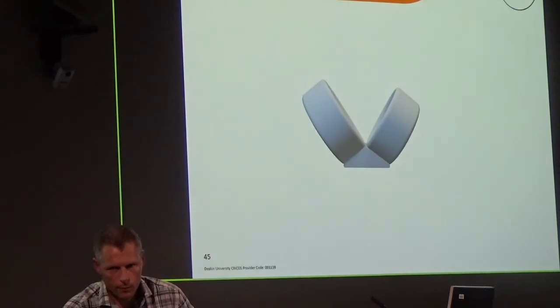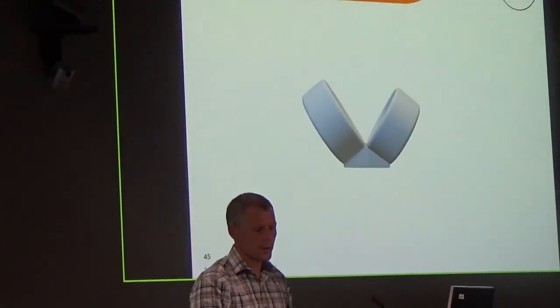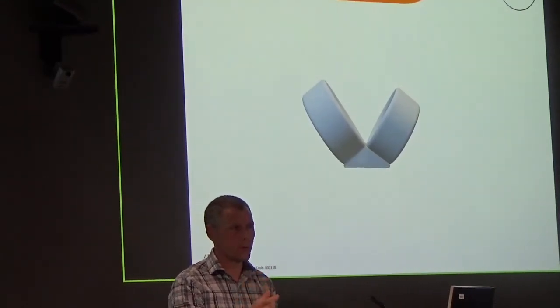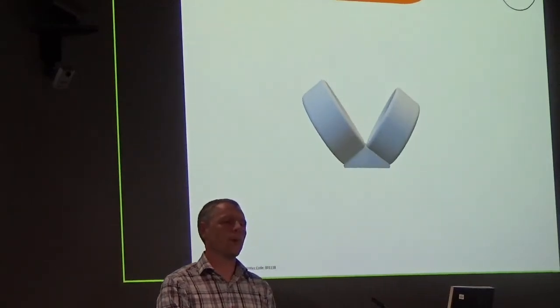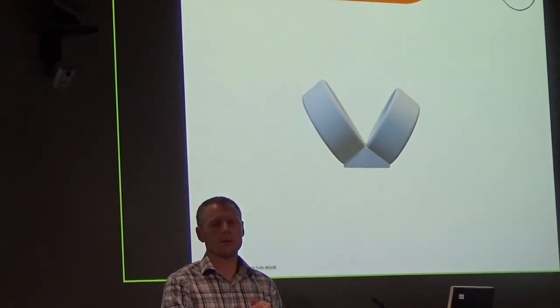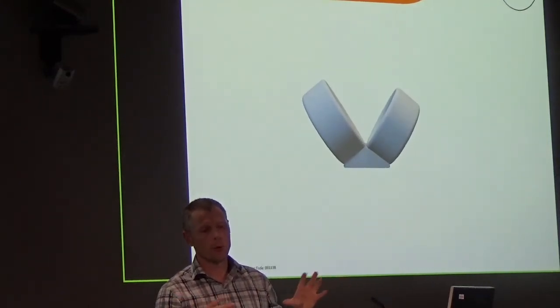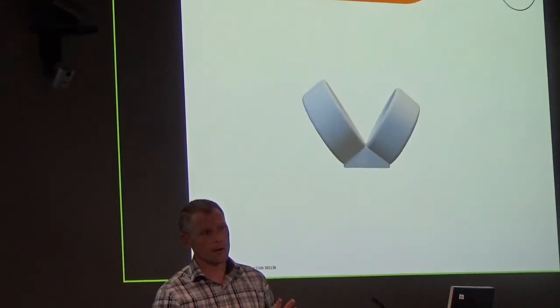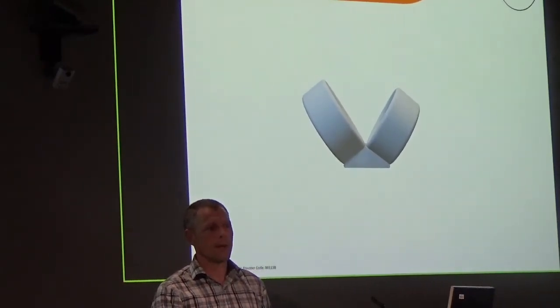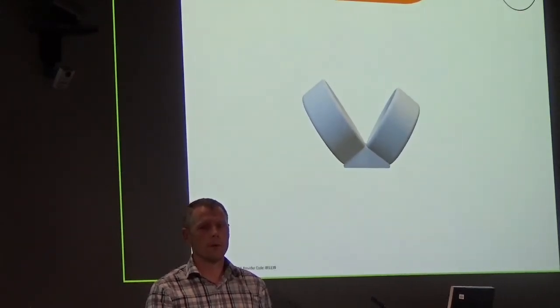Question from online: what is the plastic used? Is it affected by temperature? Can you adjust and modify it in hot water? Does it have a shelf life? Good question. This is PLA, is the type of plastic. It's high temperature, so you heat it up at the head of the printer to about 200 degrees. You can have a go at modifying it with the heat gun. That works okay, not great. I modify it with sandpaper, so I literally smooth it off with sandpaper. That's how to modify it. There was one of those earlier studies where they combined low-grade temperature and plastic together, so they're creating something similar to a thermoplastic using a printer. So there are lots of materials out there. What I used was a basic PLA plastic. That does biodegrade with a lot of time.